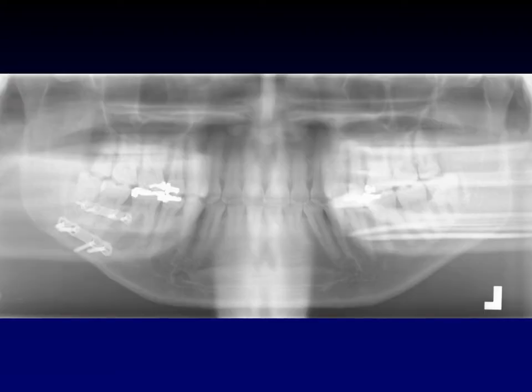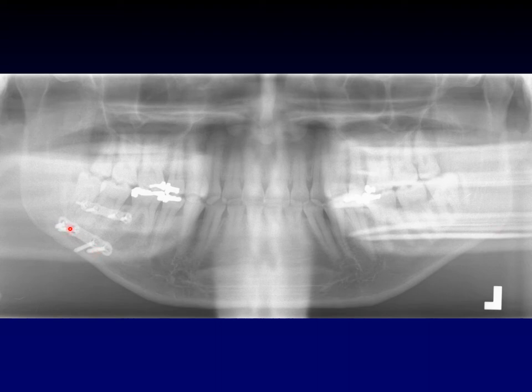It becomes an even bigger problem the more dense the metal is. Here there is something streaked out all over the area of interest — the angle of the left mandible. What is that? It's the right angle of the mandible, and it's so dense because it's got malleable reconstruction plates transfixing a mandibular angle fracture. They are obscuring the side of interest on the left as you try to penetrate through one side of the mandible and out the other side. This can be problematic in patients who have a lot of metal in their jaw.